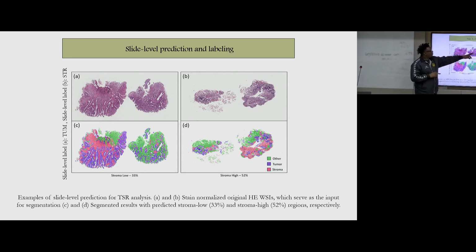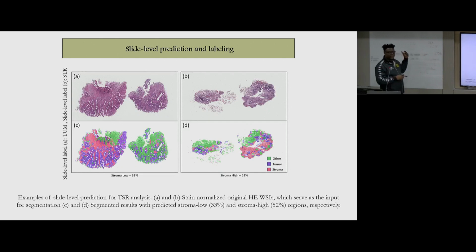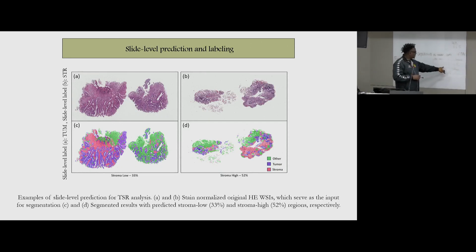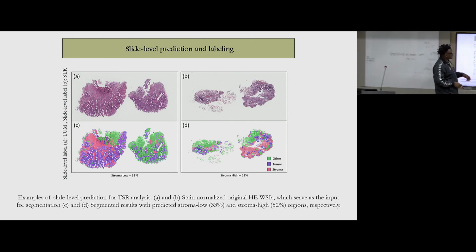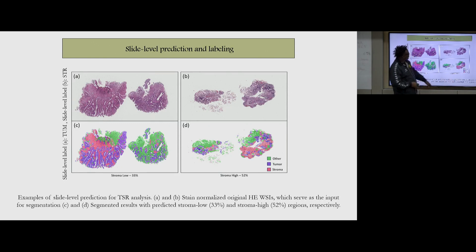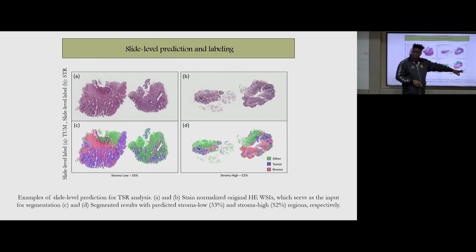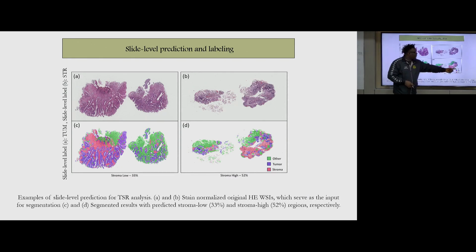Originally when we started with patch images, each patch image belongs to a class. If it's cancerous, then cancerous. But look at what happens here after prediction. In this same image, some parts are tumor, another part is another class, and another part is yet another class. So here we have 3 classes represented.